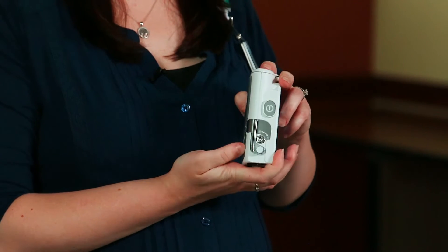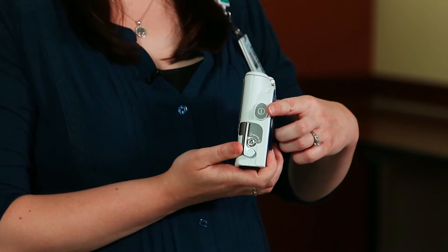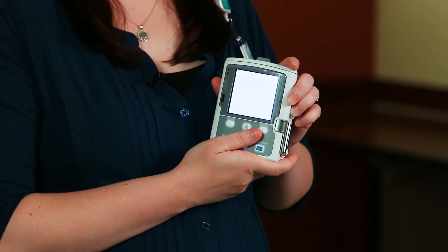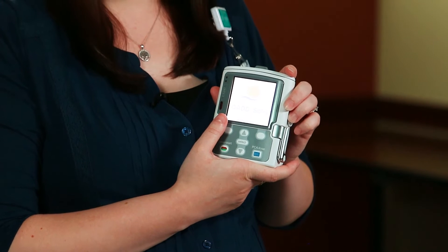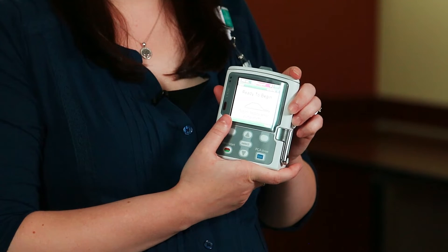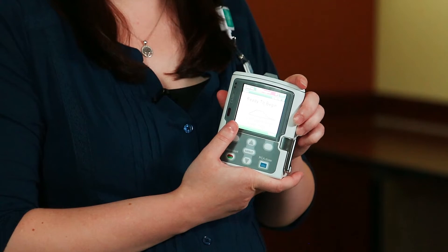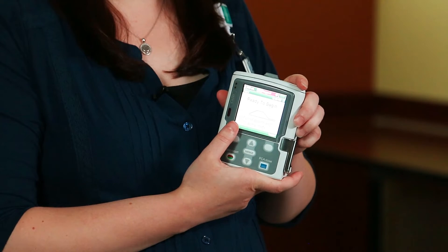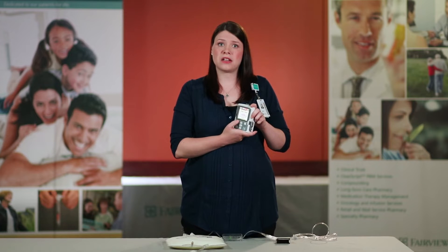Now that you've replaced the batteries, push the on and off button located at the side of your pump. This pump will go through a self-test mode and you will hear six audible beeps. Once you hear those beeps, that means that the pump has successfully turned on. If the pump has not successfully turned on, you would hear an alarm at this time. You also want to make sure that you do not attach the cassette prior to the self-test startup.